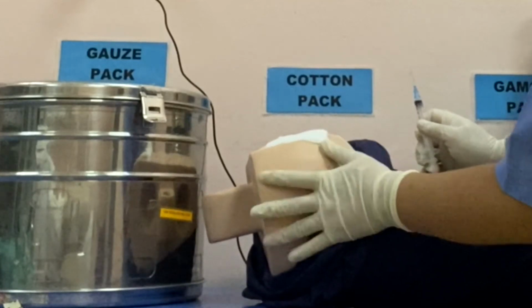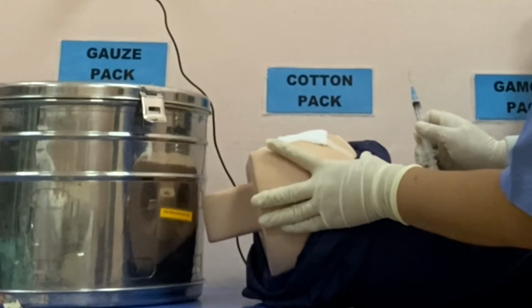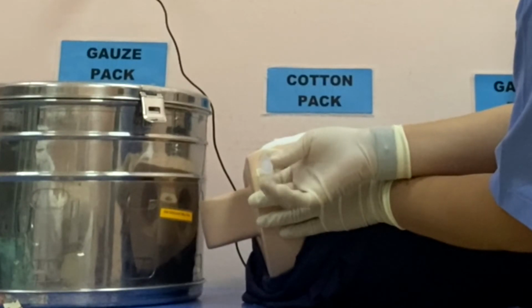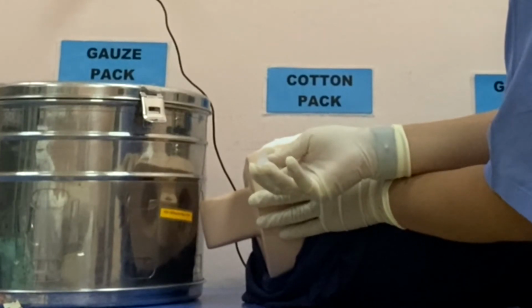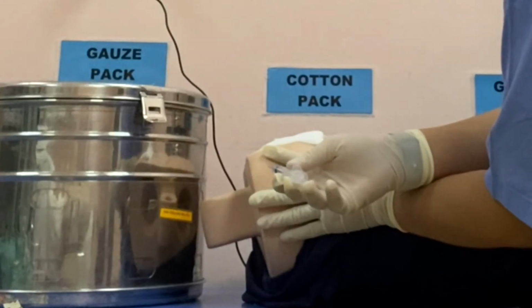This is the trochanter of the femur, and this is the location. So you can just poke at 90°, withdraw the plunger a little bit. If there's no blood, you can inject the medication, wait 1 to 2 seconds, and then you can release the needle.